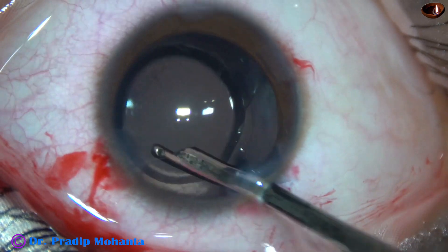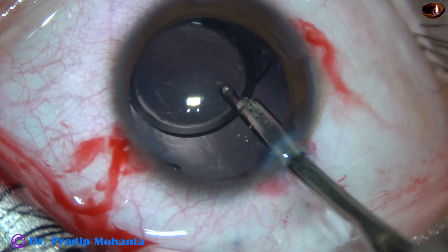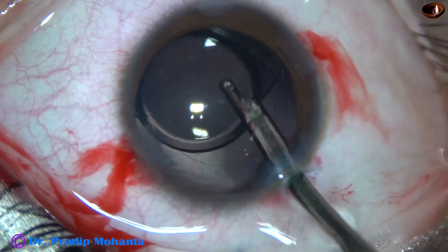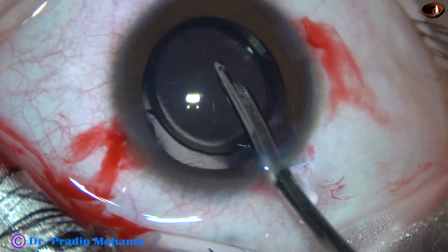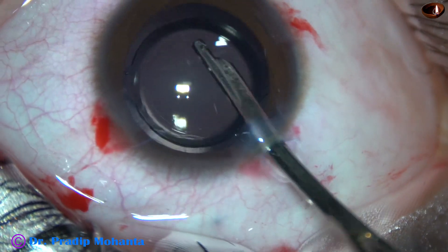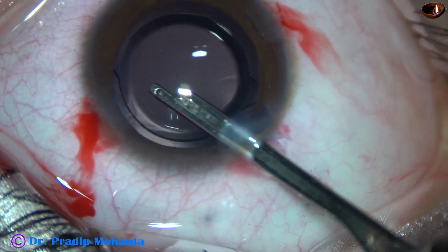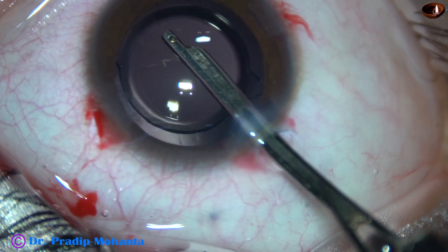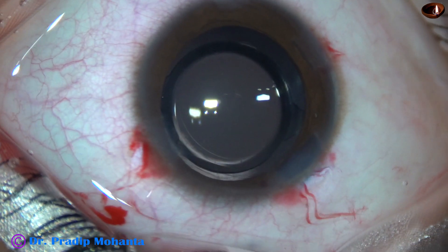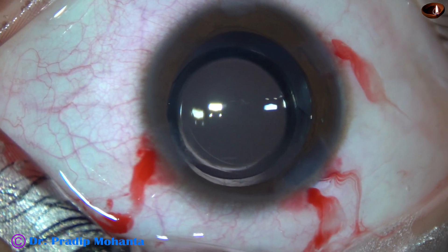Now I am irrigating out some visco from the capsular bag as well as from the anterior chamber. This is a totally unedited recording and you are watching each and every step of the surgery — you are not missing anything. My aim is to encourage you to do pediatric cataracts. Any competent cataract surgeon can do this.